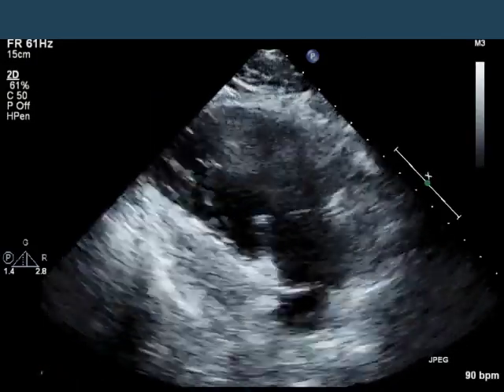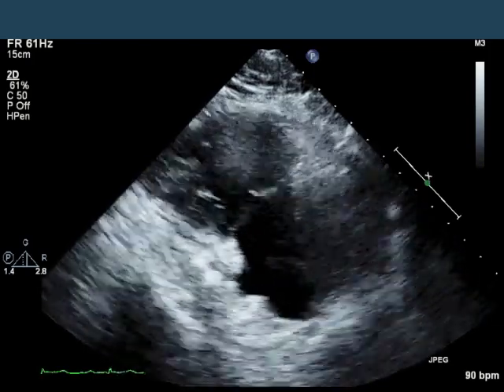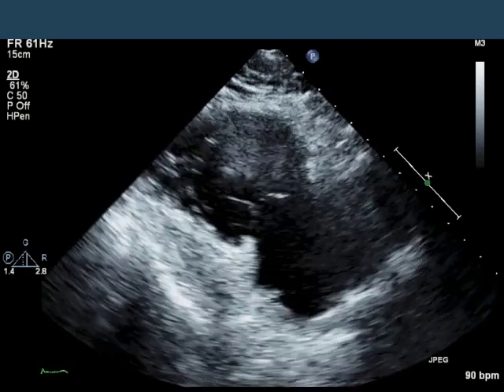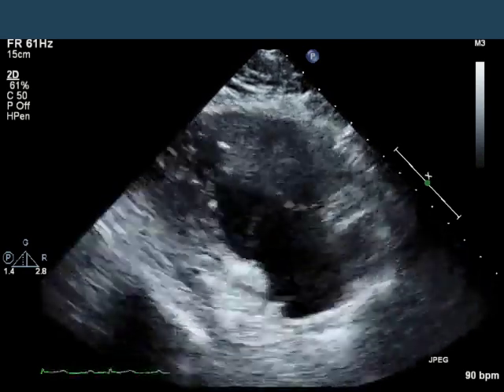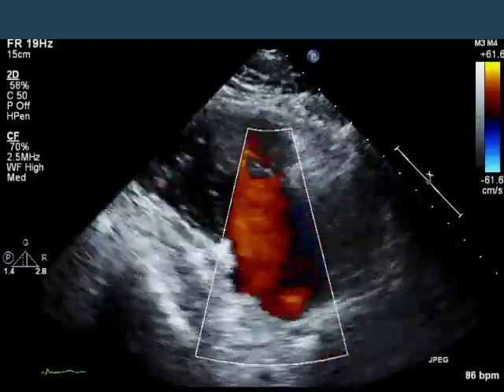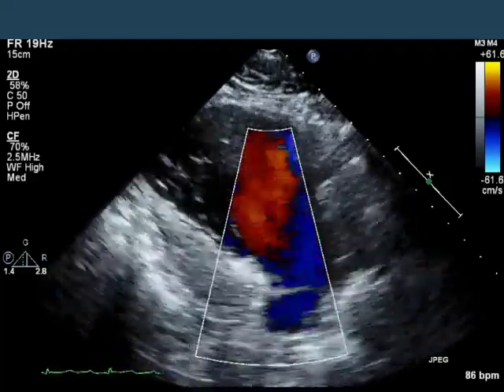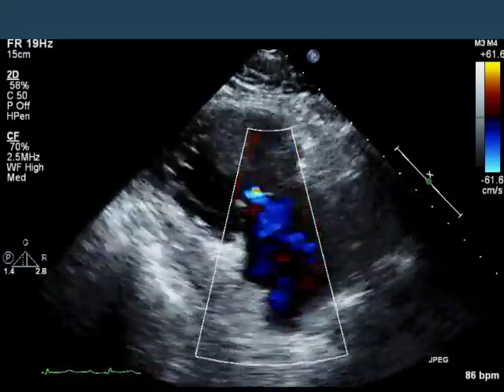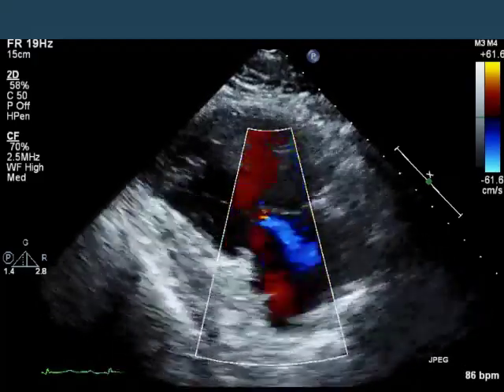You can see here an RV inflow view in 2D. The tricuspid anterior and posterior leaflets are nicely demonstrated. The RV looks perhaps a little dilated and a little hypokinetic. With color, there's some tricuspid regurgitation — not a lot. It's a fairly light blue color and doesn't look particularly turbulent.